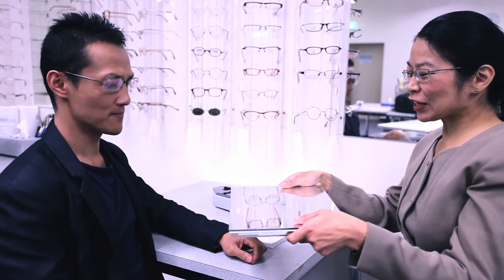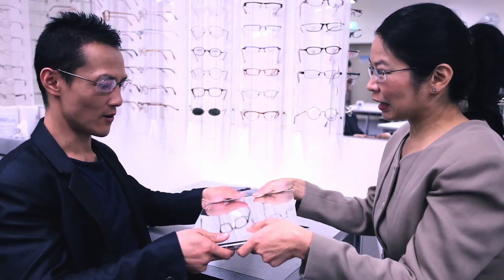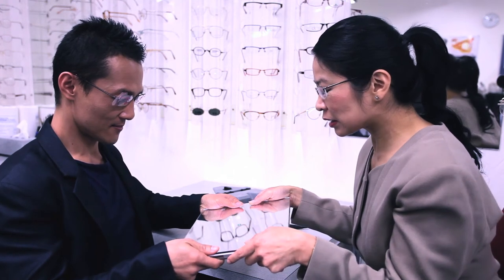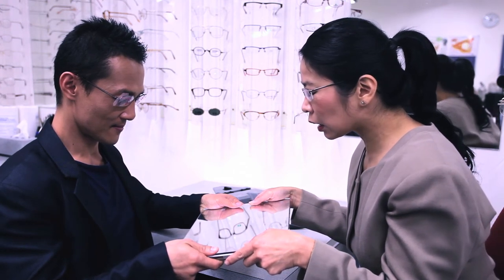The mirror is given to the client to hold like a book while looking at the circle on the mirror. The dispenser views the circle in the mirror to assess if the pupils are aligned with the lower circles. If they are not, the dispenser needs to move the gauges into position for alignment.